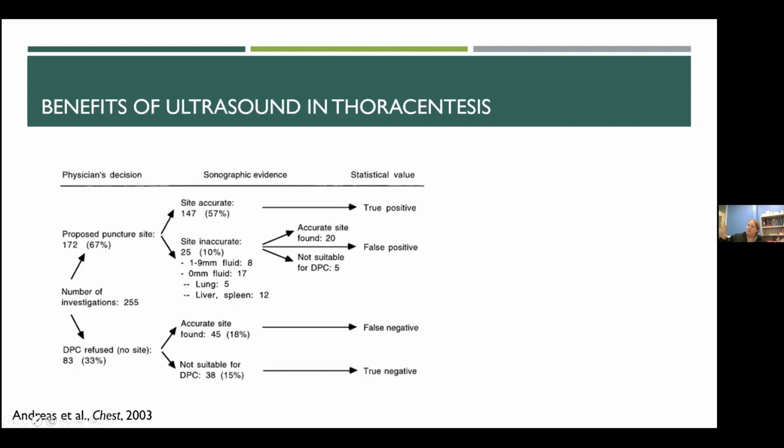So in the first top part of the graph, you can see that for 67%, they chose a puncture site. The physician said, this is where I would like to go. They then ultrasounded. 57% of those were accurate. They didn't have any additional risks that might be unexpected. However, in about 10% of them, that site was inaccurate. Either it wasn't the place where the fluid was, there was actually no fluid in about 17 of those 25 cases, which I thought was really interesting.